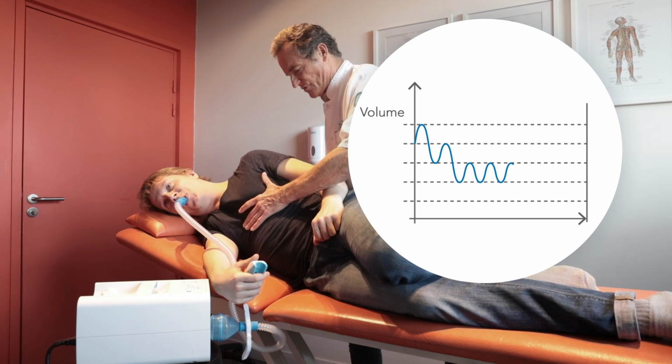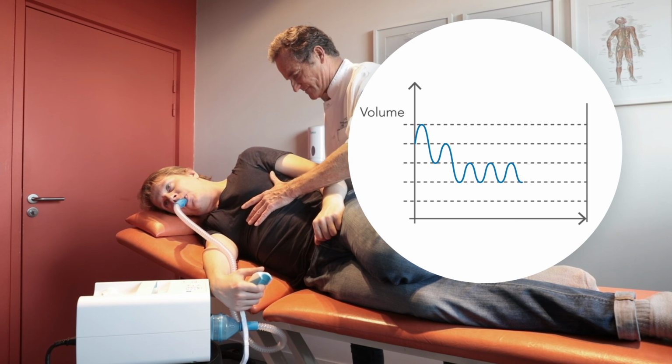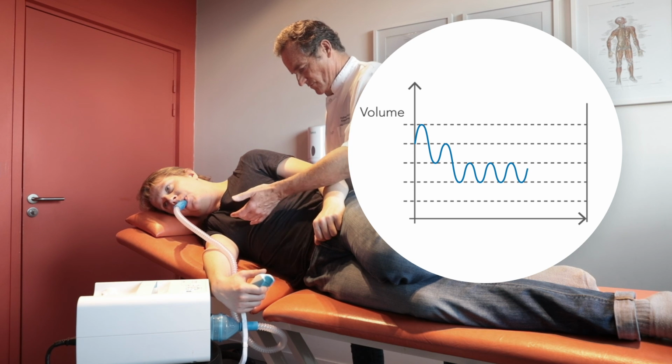During the first use, the patient may perceive the vibrations in the mouth and in the nose. They will disappear and be replaced by bronchial vibrations after a few sessions of learning the technique.